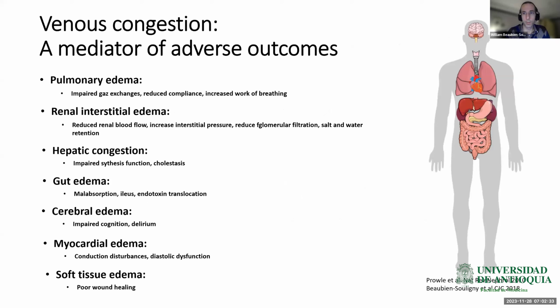With all this work on venous Doppler, we noticed that every anatomical site of Doppler assessment can have specific limitations and false positive results for different reasons. Therefore came the idea that combining multiple Doppler signals would perform better than interpreting venous Doppler at every site in isolation. So doing so, we developed the venous excess ultrasound grading system that we called the VEXUS.